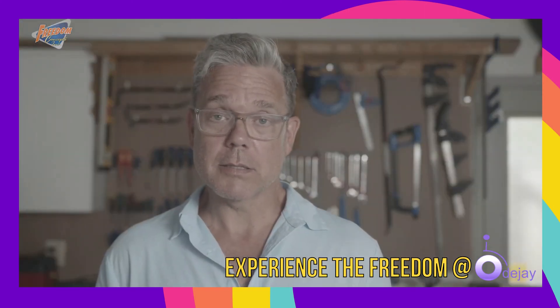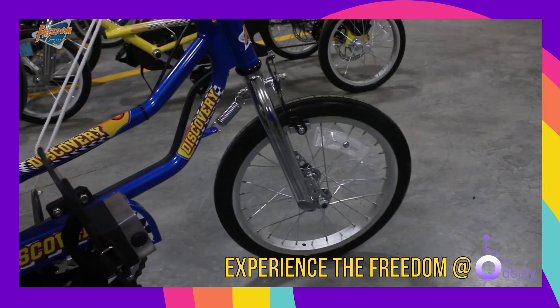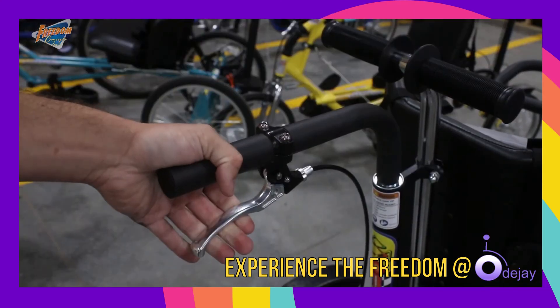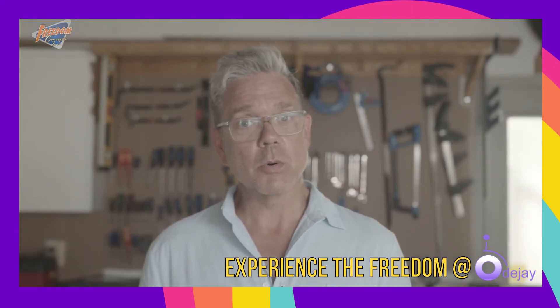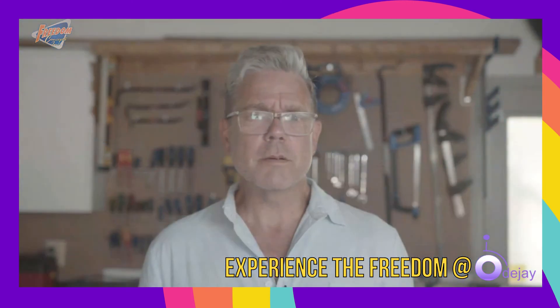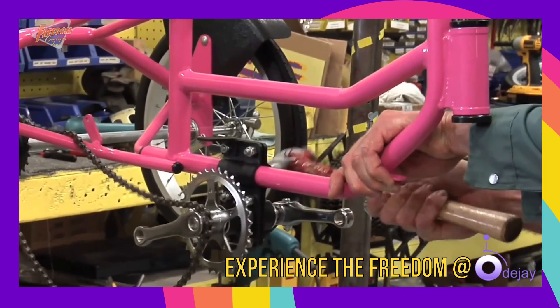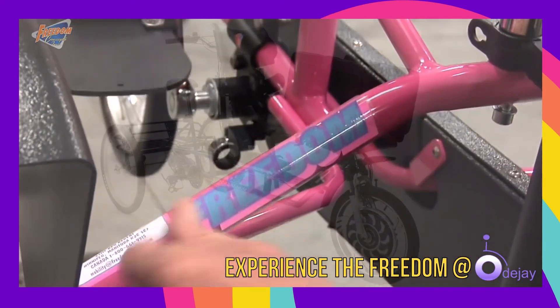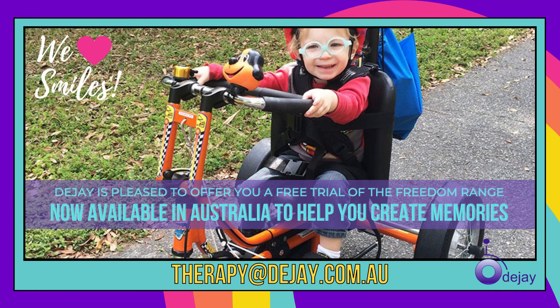When a rider is pedaling as hard as they can and they still need a little help, we have the rear steer handle which allows the attendant to give that little bit of help that is required. They can steer and brake for the rider. In more extreme cases, we are able to add an electric assist motor. Freedom Concepts also offers many other optional accessories to ensure that our bikes work for your child. For a full list of available accessories, please visit our website at freedomconcepts.com. Because all of our bikes are built from start to finish in our warehouse, if you need something custom made, our team of engineers and builders can create something that will get you or your child riding. If you want to ride, we can make it happen. Thank you.